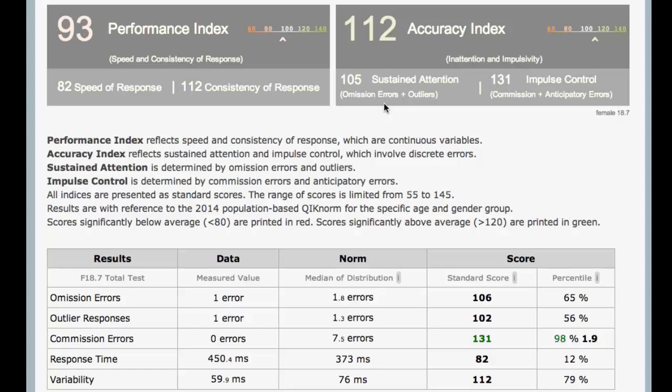An outlier is just — oh, I was going to respond, I just responded late. And if it's late enough, then we classify it as an outlier, and then we lump those omissions and outliers together into sustained attention. And then that gets combined with commissions and anticipatory errors into this accuracy index.